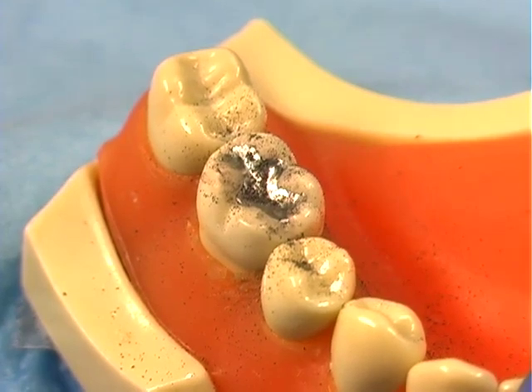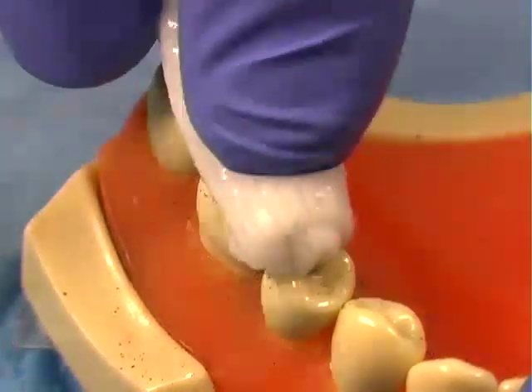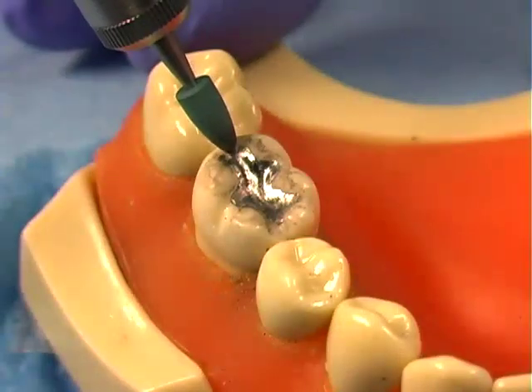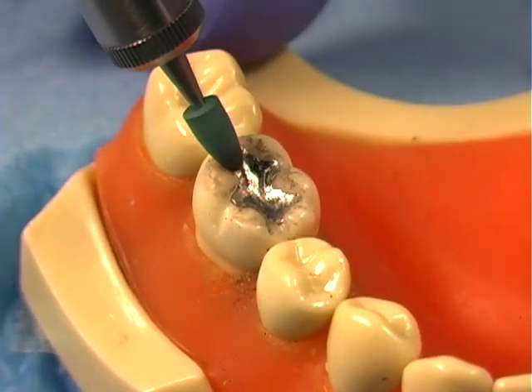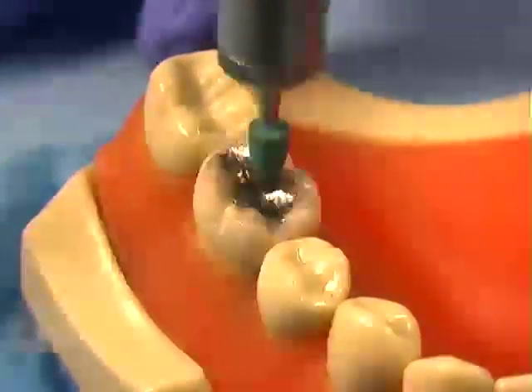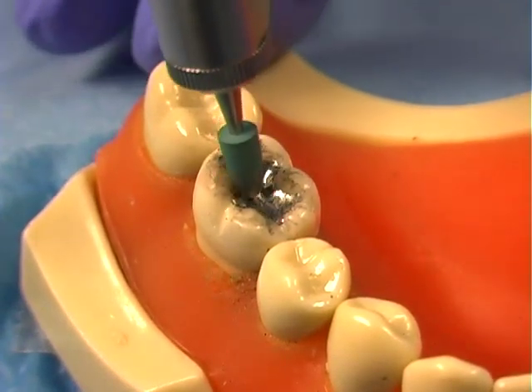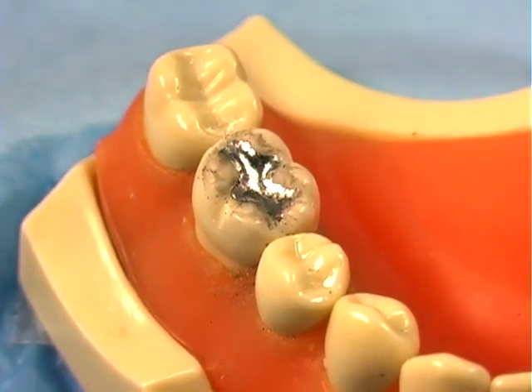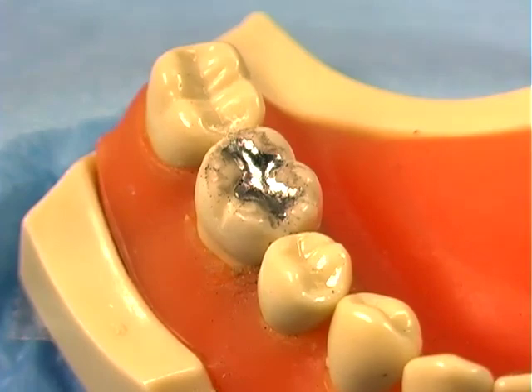Rinse the surface to cool and to clean. Insert the less abrasive greenie point and polish the grooves on the occlusal surfaces. Rinse with water to cool and to clean.